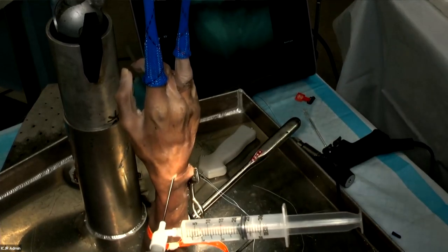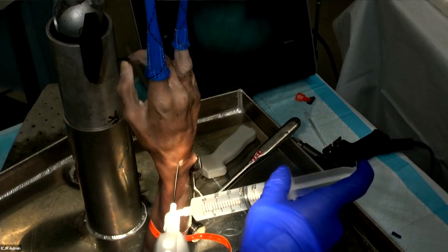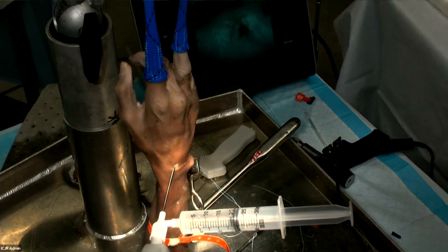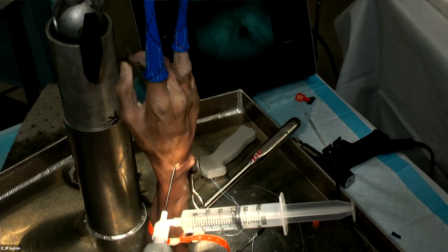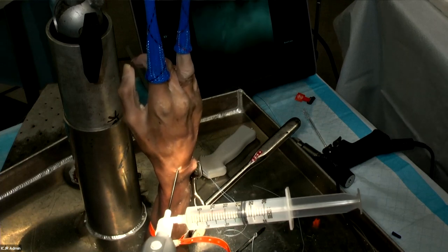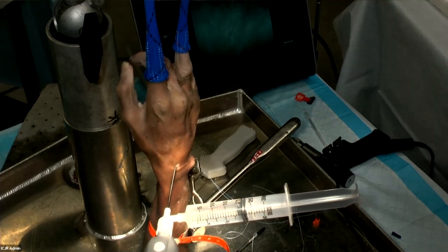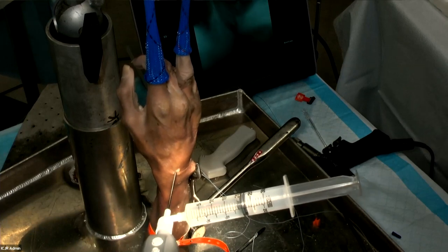We did this low-tech without fluoroscopy, so it's probably not quite perfect, but this is a cool technique. It's all arthroscopic — the hardest part is placing the wires in the right spot. Since fellowship, I've used an arthroscopic-assisted approach to TFC repairs because the most important part is where the sutures go through the TFC. With excellent visualization, you get the repair in the right spot. My partner Bill Kleinman is a maestro of open TFC repairs and would argue with me, but this is a cool technique among many.